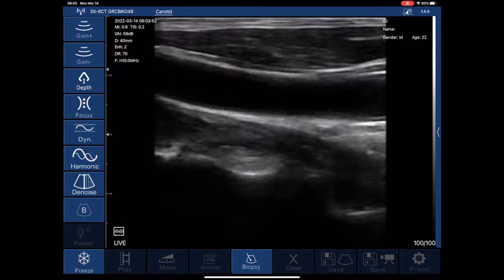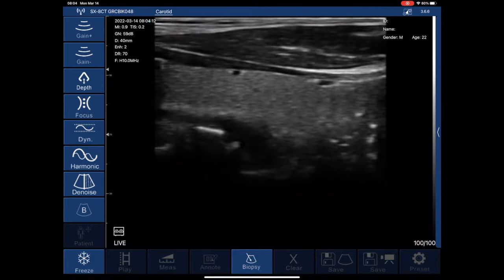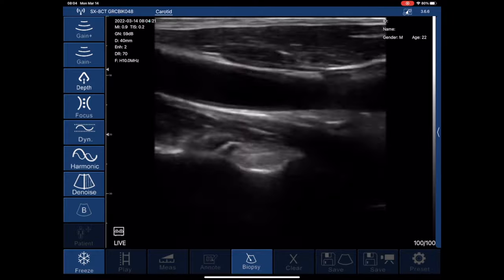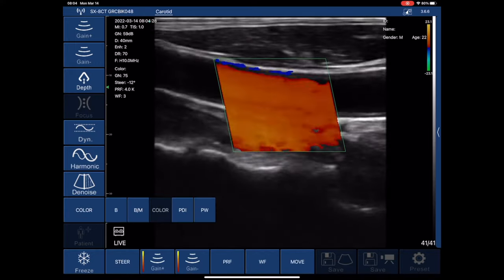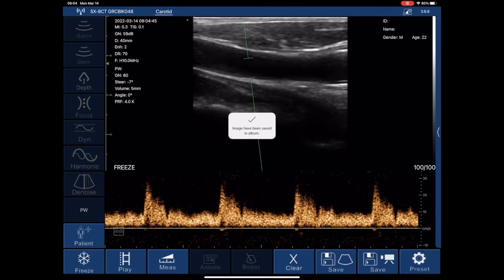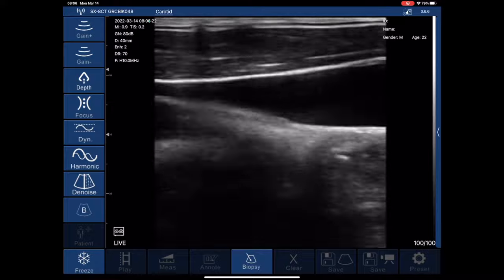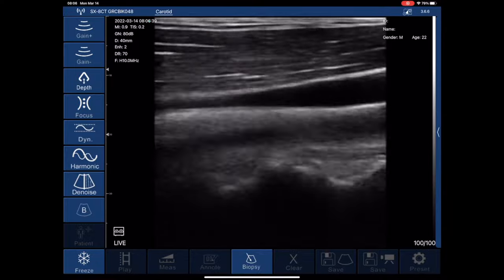The next scan is a carotid artery scan. You can see the vessel very clearly, adjacent to the thyroid. We can use color Doppler as well as pulse wave Doppler to see if the flow is patent and to check the velocity of the flow. You can also see the jugular vein adjacent to the thyroid and the carotid artery.